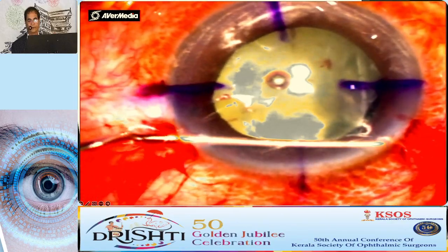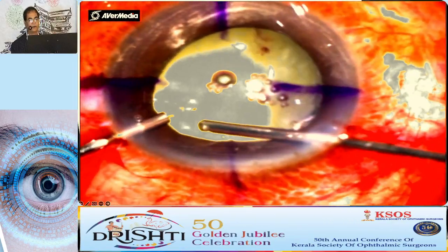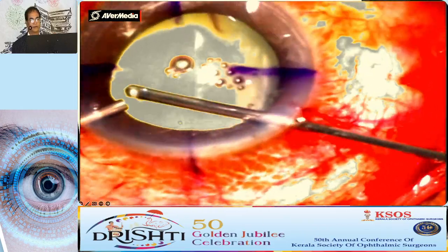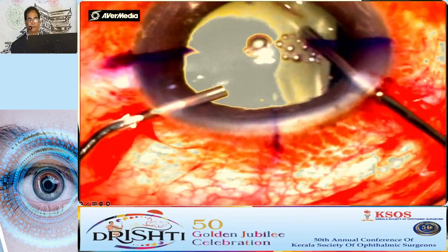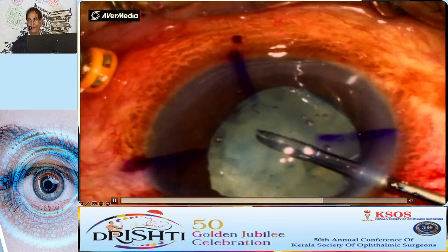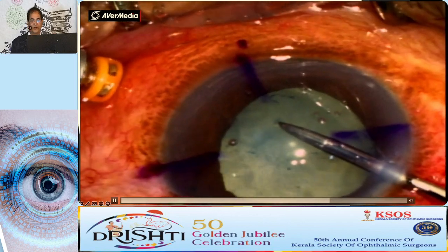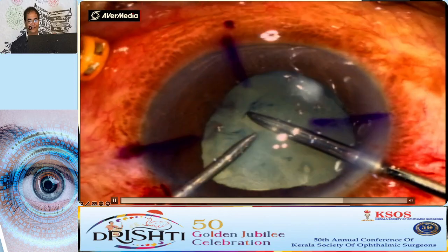You can see these vitreous fibers are still there because of triamcinolone, it is stained, and I'm just removing that, also because it will keep on coming. Now the very important question in this case is to do rhexis. Rhexis you cannot do normal, so this is like bimanual rhexis I do.